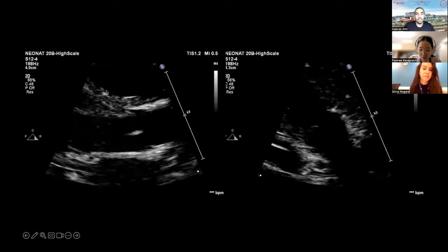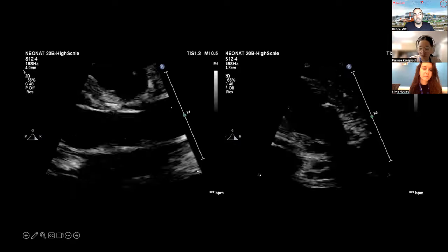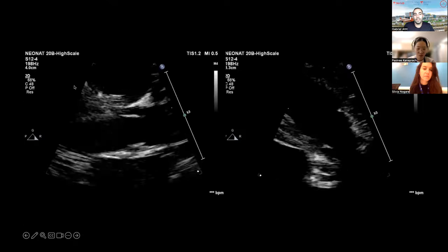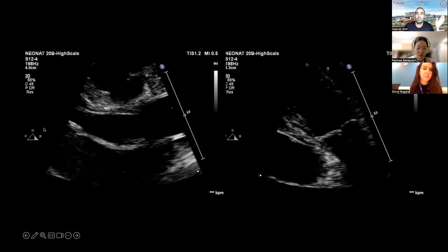The other thing that this image provides you is the information of how deep you are in your cut. So this image is going up to 4 centimeters. All this information has meaning, so it's important you guys know when you're scanning what this information is telling you.